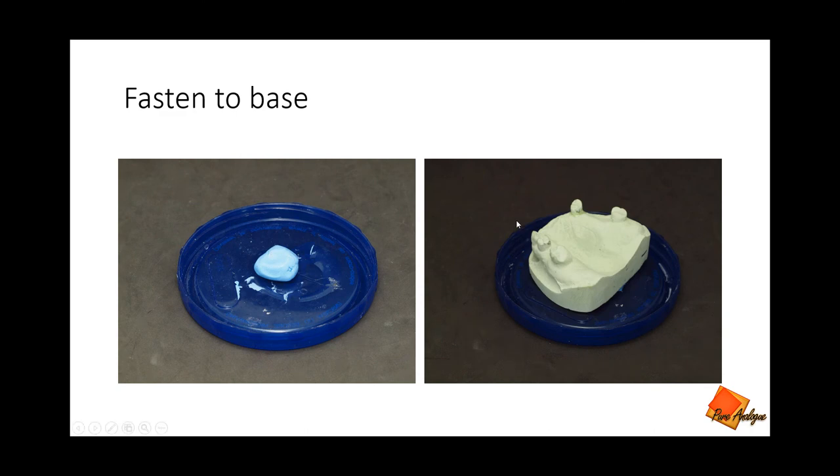Then you have to fasten your model to the base because when you start to pour the silicone, you don't want it to float or drift. What I did was I took one part of the two-part GC LT Putty and put a little ball down here. It's sticky and tacky, then I just take my model and press it down on top of that, and that'll fixate the model to the inside of the lid so it won't float when you pour.